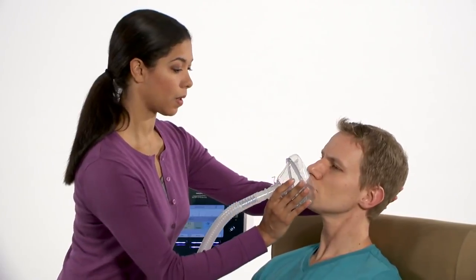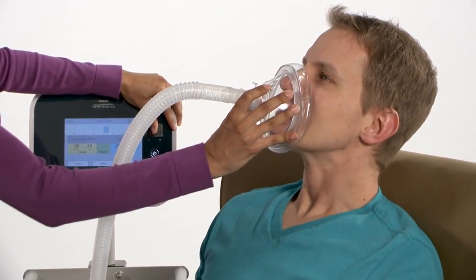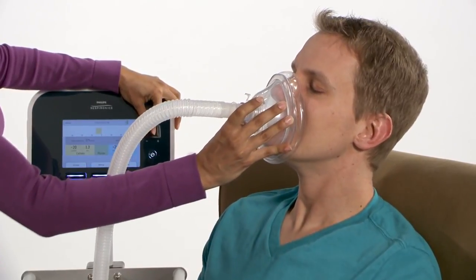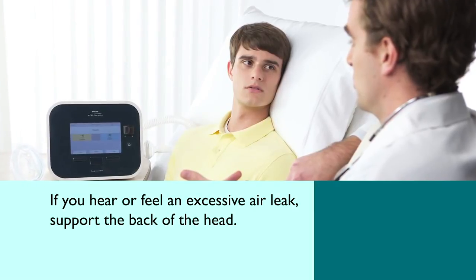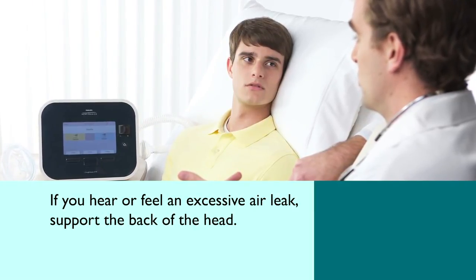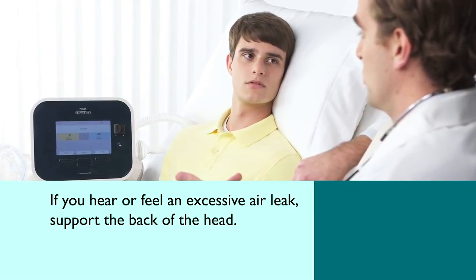Position the mask, mouthpiece or trach adapter on the patient. When using a mask, make sure it is well fitted to eliminate possible leaks. If you hear or feel an excessive air leak during the inhalation period, support the back of the head with your hand or a pillow to improve the seal.